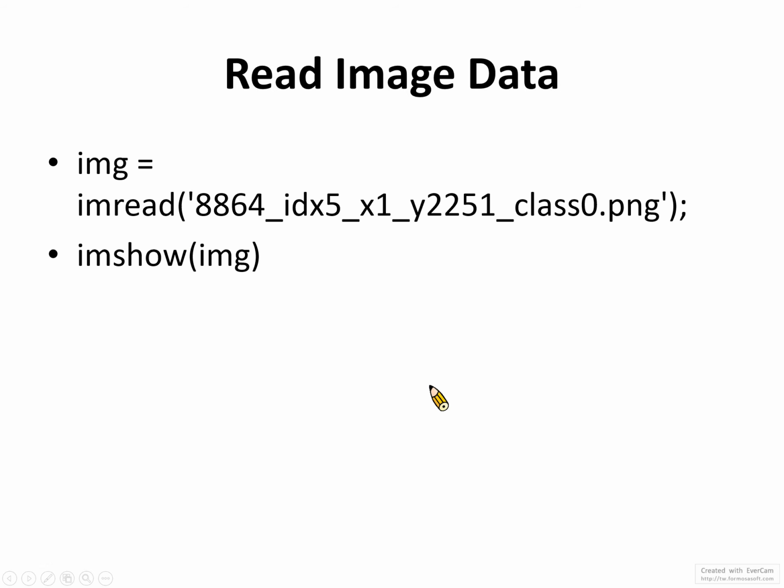Okay, so let me show you how to read the image data. Remember in our first workshop, I showed you how to read chest X-ray images using MATLAB. At that time, because the chest X-ray was stored in DICOM format, I used dicomread to import those DICOM images. But these pathology images are in a conventional image format, PNG, so we just use imread as the MATLAB function to read these images.